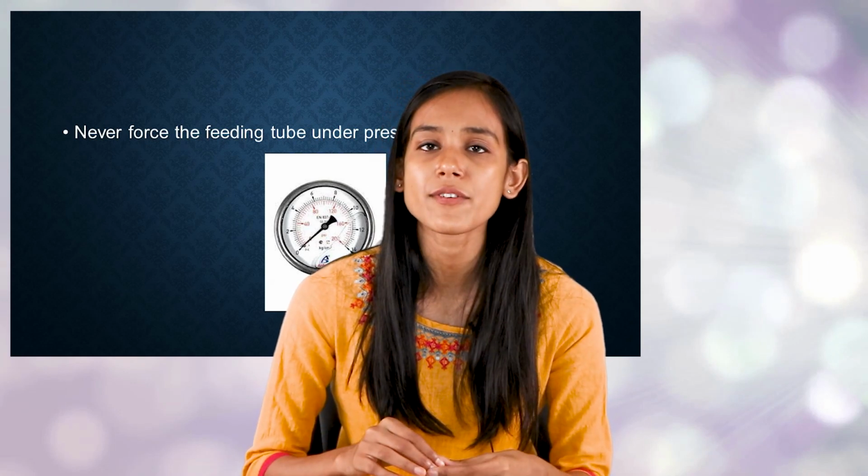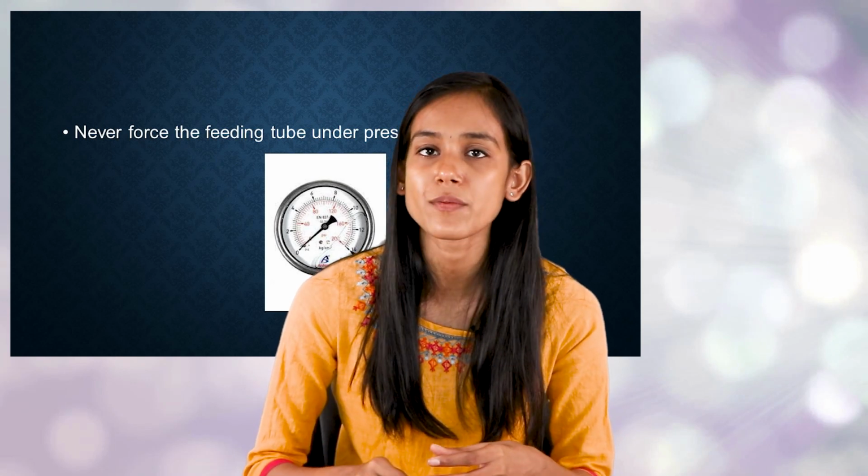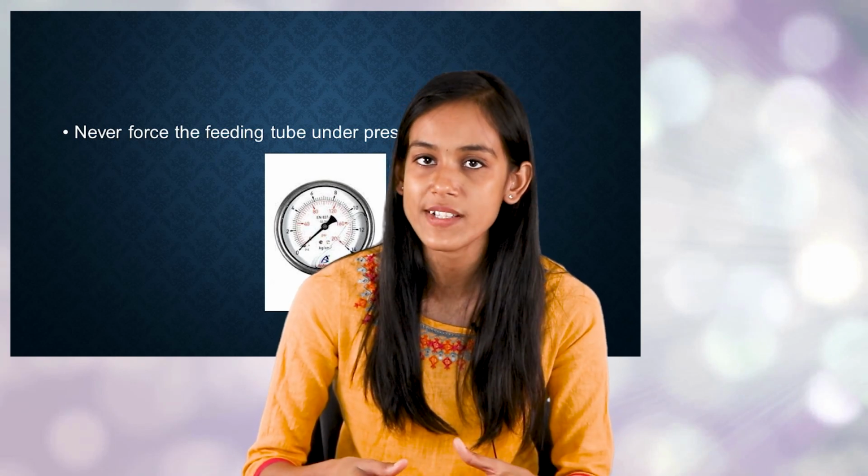Now, the next thing is you should never force the feeding tube under pressure. So while inserting, if you feel any kind of pressure which is blocking the tube from going inside, you should hold it back, wait for some time, and then try to reinsert the tube. But you should not force the tube inside under any kind of pressure.